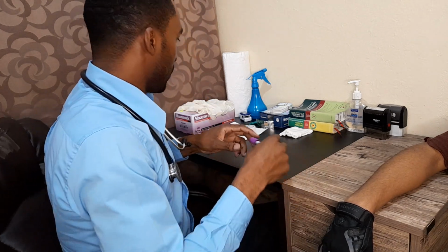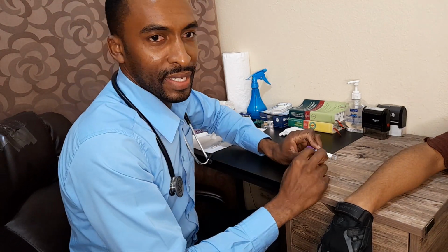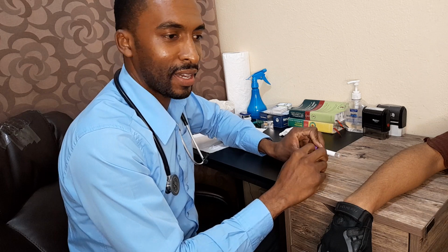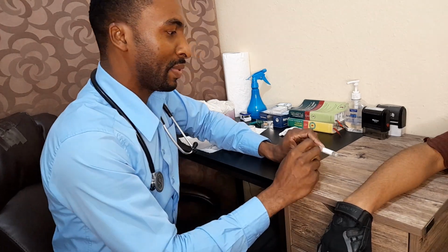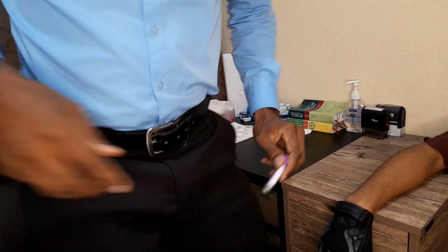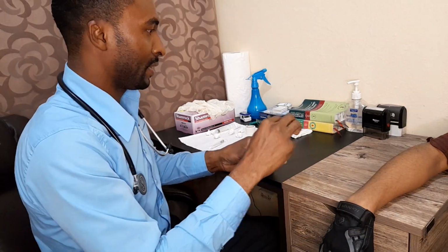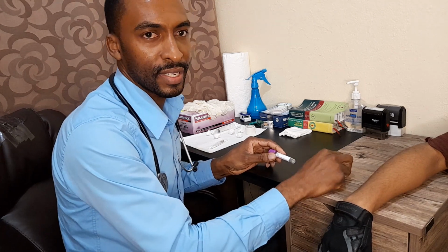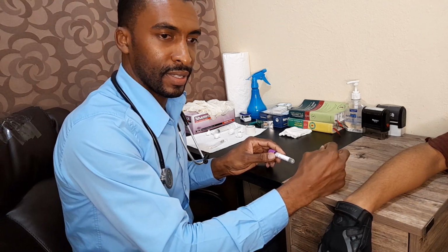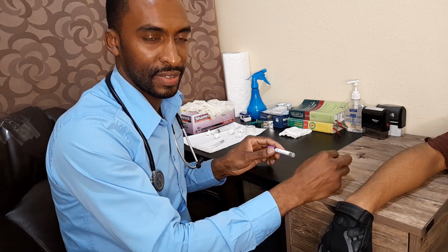All right. So normally we should write the name of the patient on the tube, but we are going to do that after the video, since in terms of privacy we don't want to indicate who the patient is. But we normally write the patient name on the tube, and we would also fill out a form which has the patient's biographic information such as name, age, sex, date of birth, address, etc.